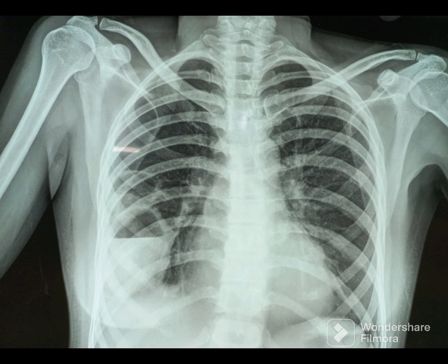Note the semicircular wall enclosing the line — it is the wall of the cavity. So we have fluid inside the cavity. In addition to the large cavity in the right lower zone, there is a smaller thin-walled cavity in the right mid zone as well.